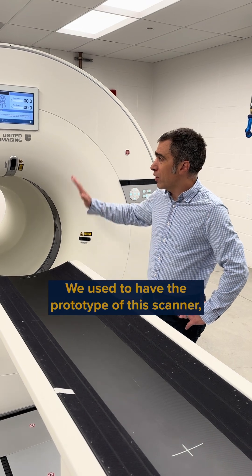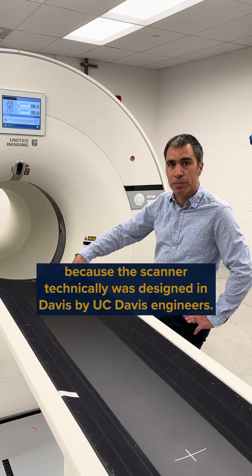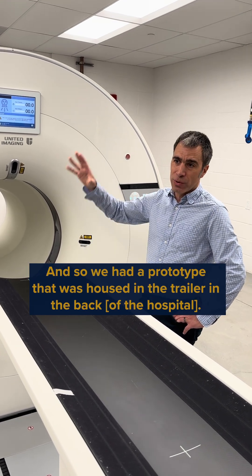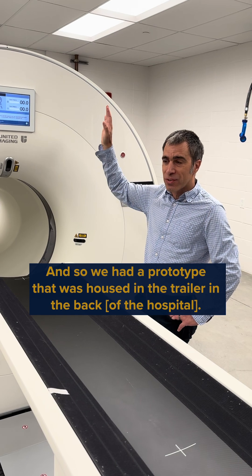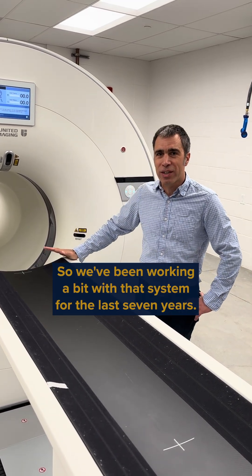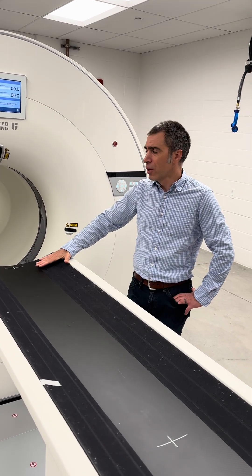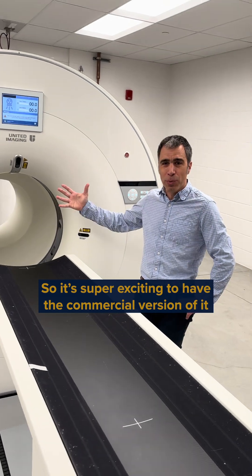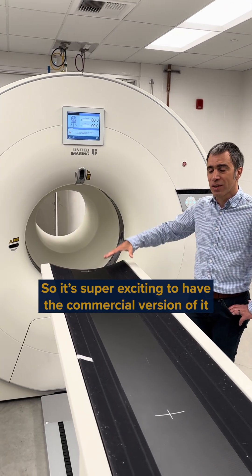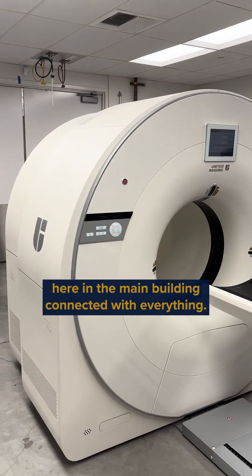We used to have the prototype of this scanner, because it was technically designed in Davis by some Davis engineers. We had the prototype housed on a trailer at the back, and we've been working with that system for the last seven years. We had quite some limitations working on the trailer with the prototype, so it's super exciting to have the commercial version here in the main building, connected with MSC. Thank you.